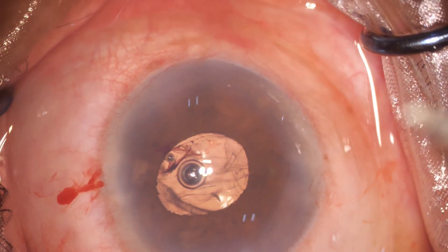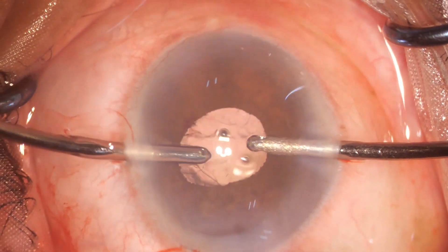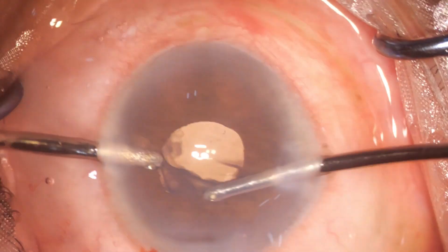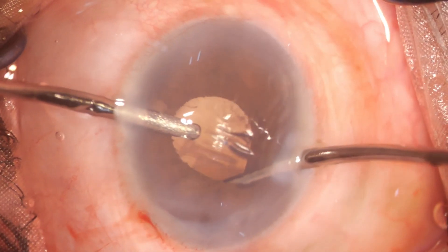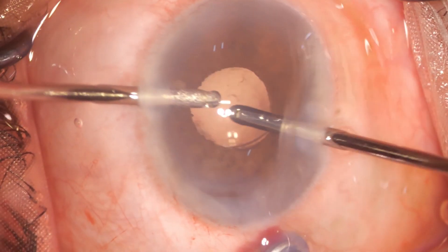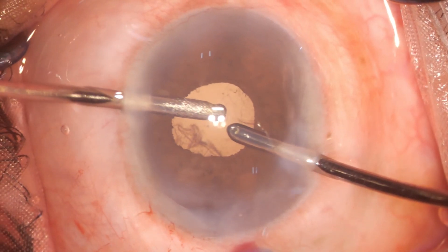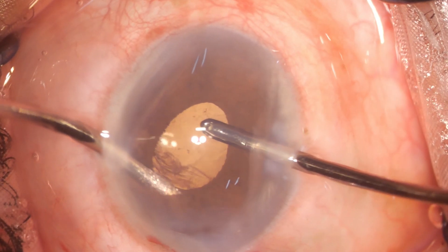Now, to remove this cortex is a bit difficult. In normal cases one can rotate the lens, but here a 52-diopter IOL is very, very large — it's filling up the whole bag, not allowing any place or space for putting the aspiration probe.